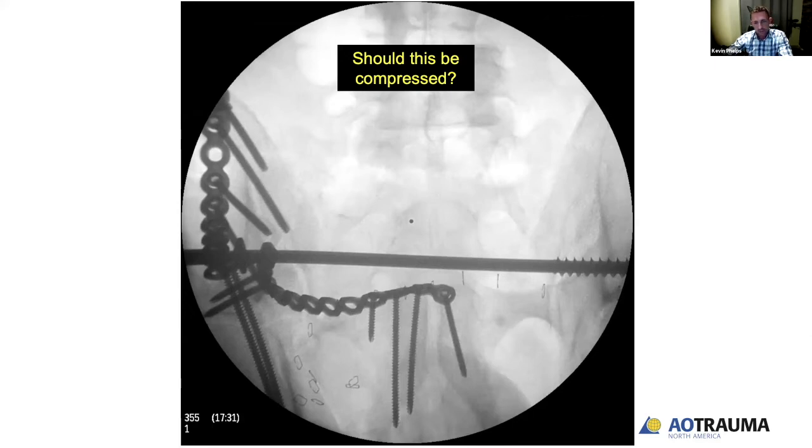Those are the images that are actually more useful, but it doesn't typically save those. So I adjusted it once and then spun the patient again. I thought the reduction looked pretty good on the intraoperative CT scan. So I elected to place a transiliac transsacral screw at the S2 level. At this point the sacrum's distracted a little bit, and I'm curious to get people's opinions on compression.